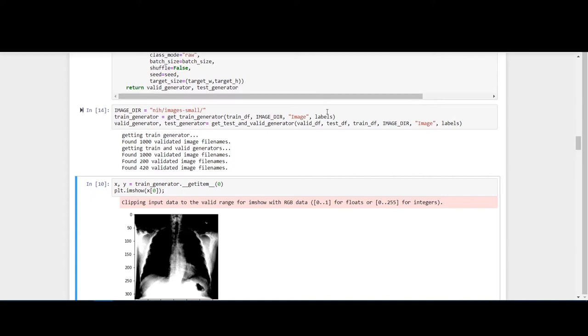So these are just 1000 images. The whole data set is above 40 GB and has 110,000 images. But when we trained on these 1000 images, it took us around 1 hour to train. Our machine is GPU equipped, so it took 1 hour. Just imagine having to train on 110,000 images. It will be super heavy on the machine, and it will be very time consuming.